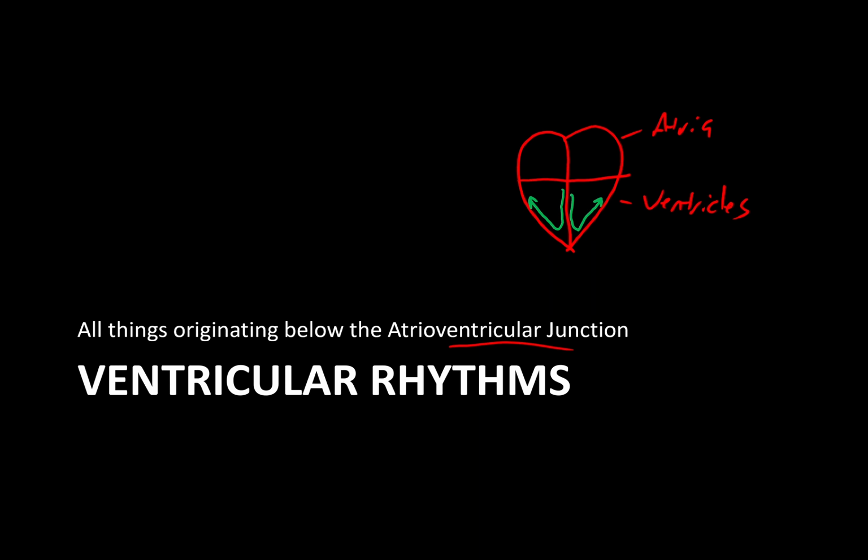To just give you a rough outline, for the basic arrhythmia folks, it's going to be pretty straightforward stuff with bundle branch blocks, PVCs, V-Tach, and V-fib. Asystole and PEA.